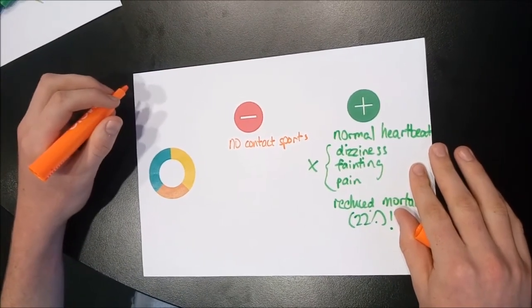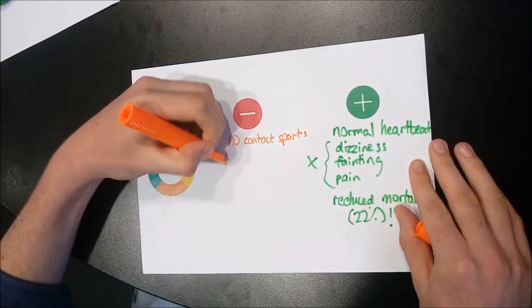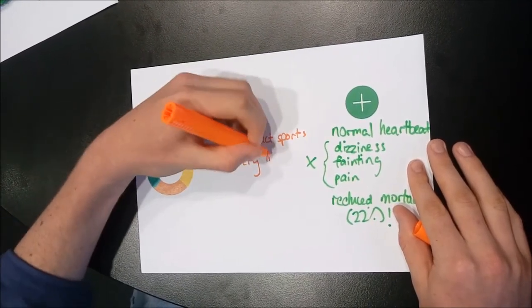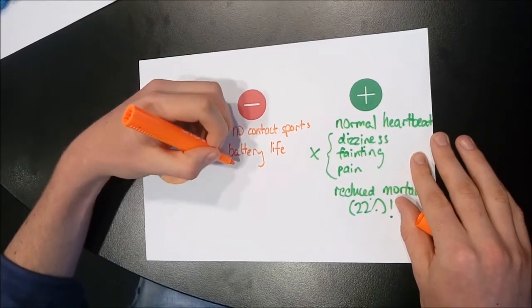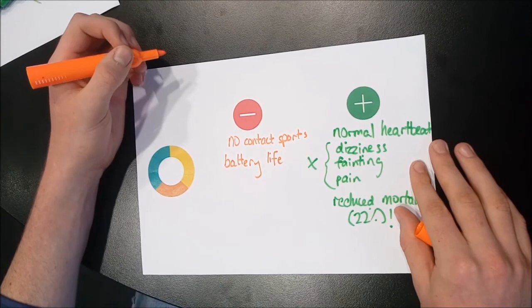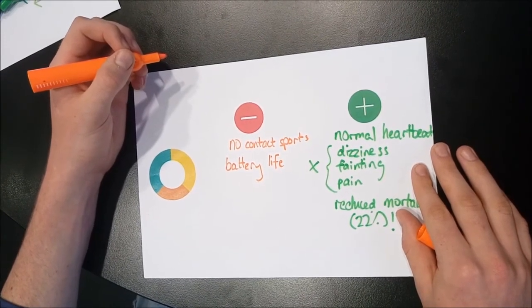Furthermore, pacemakers often have finite battery lives. The battery life on average expires in 6 to 7 years after the original surgery. To replace the battery, surgery is usually required. However, this is generally less invasive and requires less recovery time than the initial implantation.